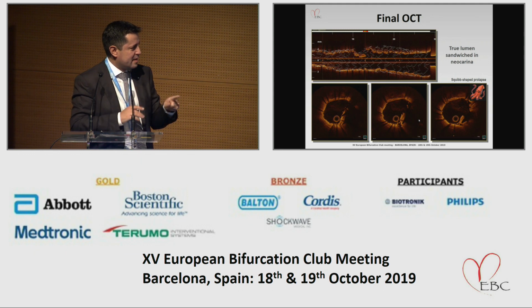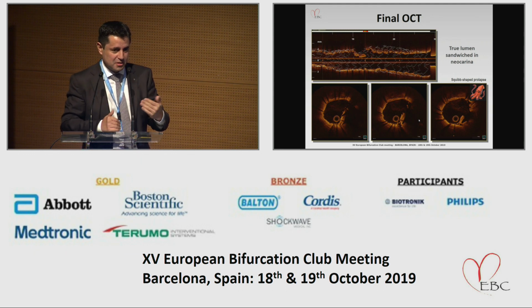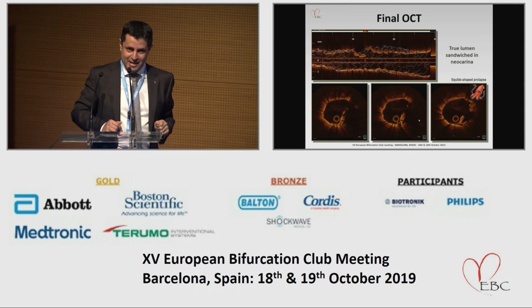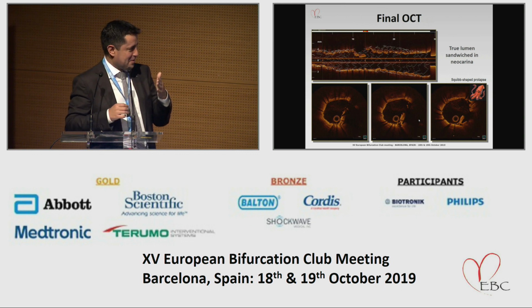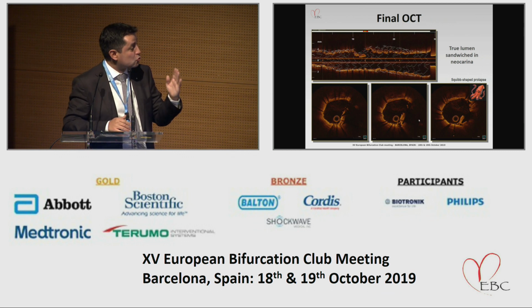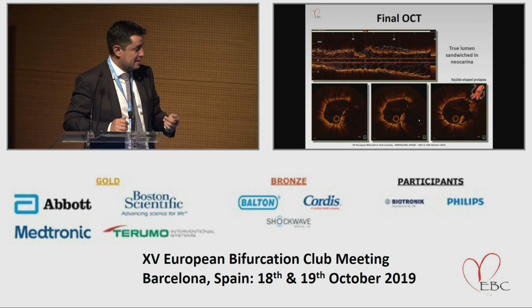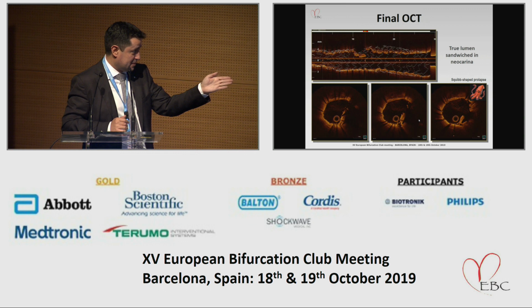Never mind, let's dilate. The first antegrade injection after dilation was encouraging, even though everybody here had voted for something different. But in the lab, all the experienced operators agreed to try to adjust the stent to the ostium of the LAD. Mistake. Overconfident again. Then happened what you have seen and you anticipated.